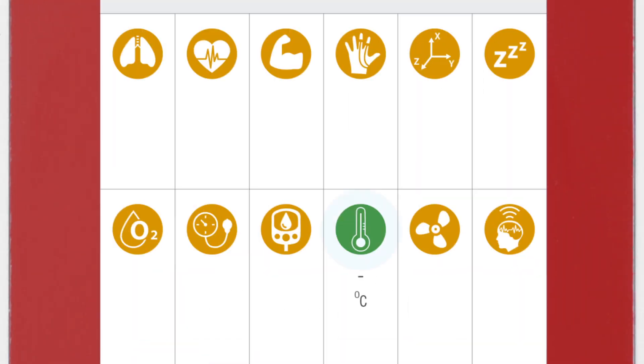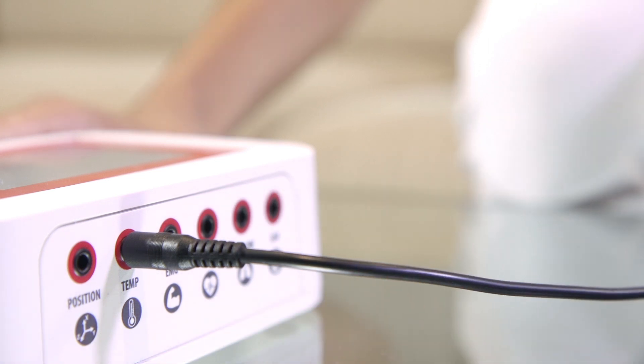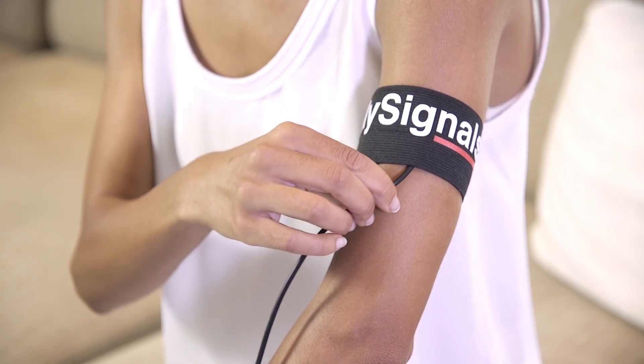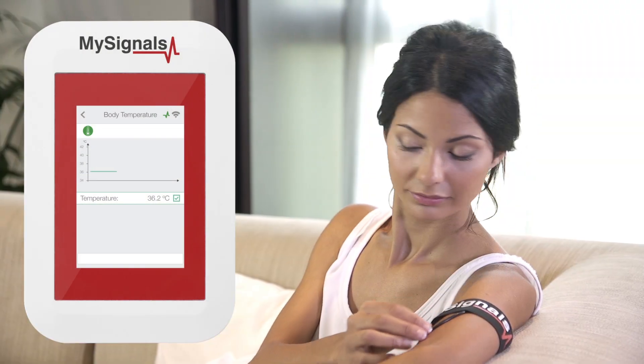Click on the sensor icon to start real-time data visualization. Connect the jack sensor in the temperature connector in the MySignals device. Put on the armband and then put the sensor inside it, in your elbow inner side, making contact between the metallic part and your skin. Now you can visualize temperature values in real-time on the MySignals screen using the Standalone mode.